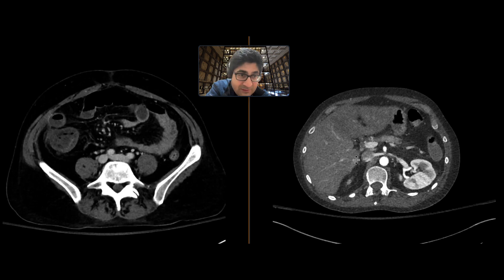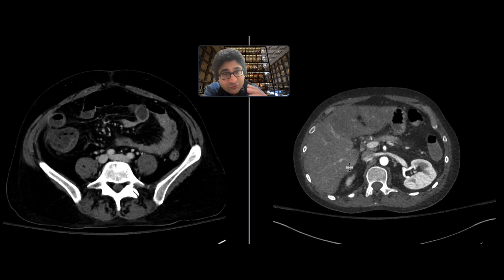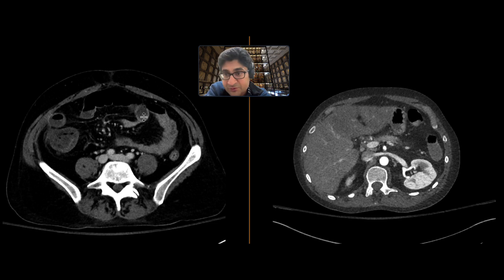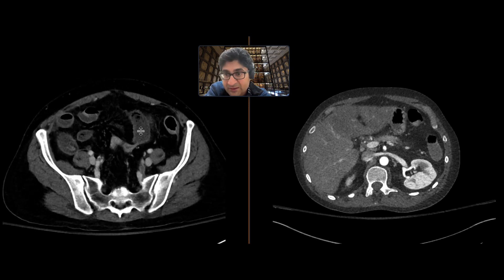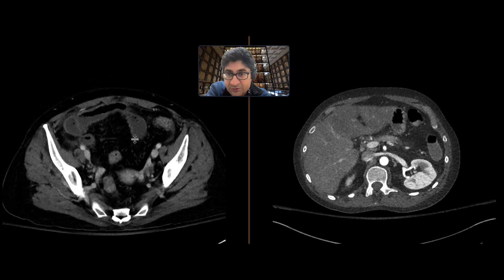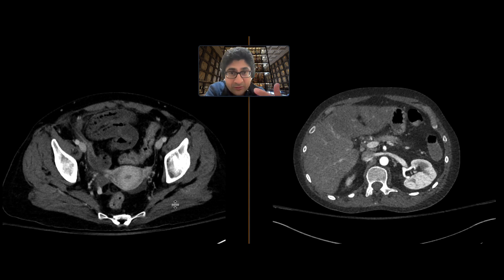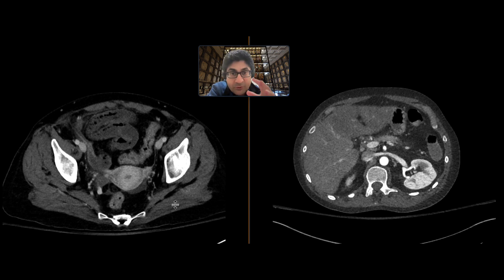We don't quite see a filling defect in the SMA going all the way down, but it's reasonable to assume, given there's thrombus throwing off emboli and affecting multiple organs, that the appearance of the distal small bowel is concerning for ischemia. This ended up being resected — this was bowel ischemia — and certainly all the other findings were compatible with multi-organ ischemia in the context of this thrombus.